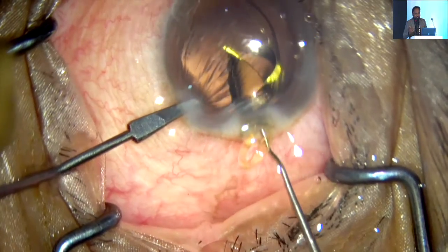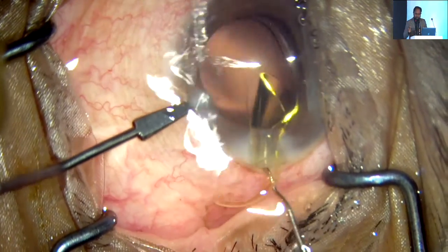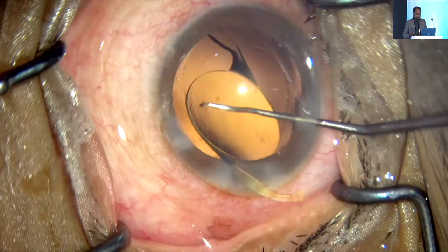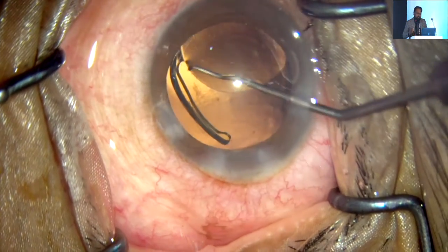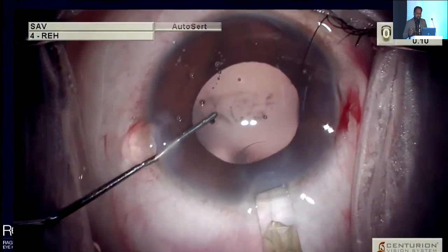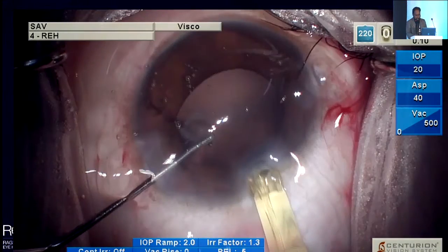If almost 3/4 is inside, you can use this push technique where you just gently close the lens and then try to push it inside, just not physically push it inside with the same wound, without extending the wound. And then dial the lens. And make sure you always use more viscoelastic in the antechamber, because when you're doing these maneuvers, again the lens can go and hit. And this was shared by my good friend Samresh right now on stage.